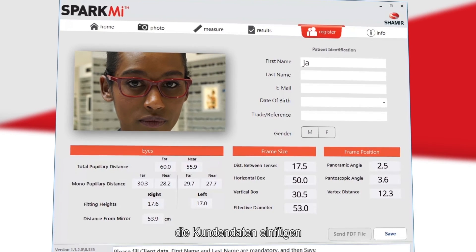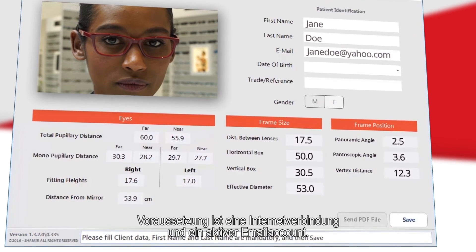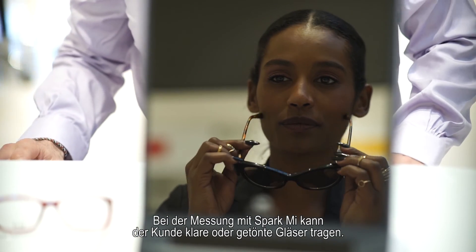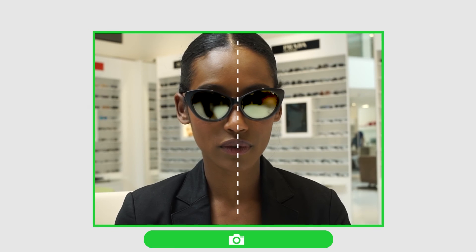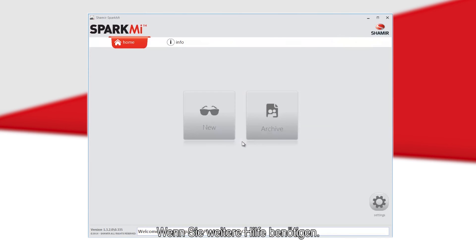Once you have marked all points and viewed the results, save the results by selecting Register, typing the patient's info, and pressing Save. Results can be emailed by selecting Send as PDF at the bottom of the results screen; however, an internet connection and active email account on your PC are required. With SparkMe, the patient can wear clear, dark, and even some mirror lenses. For additional help, the SparkMe manual and video tutorial can be accessed from any screen by clicking the info icon.